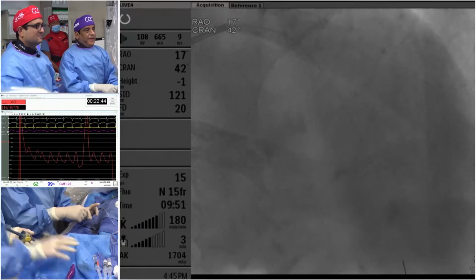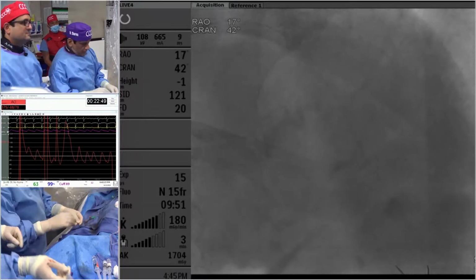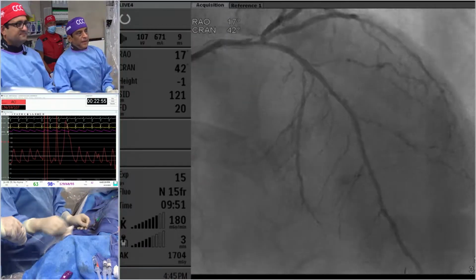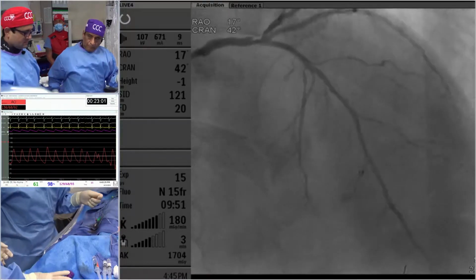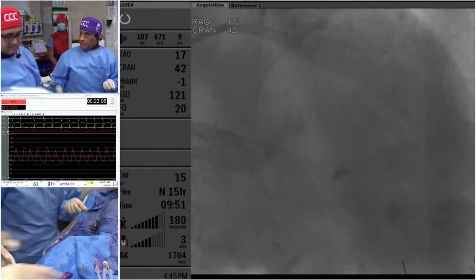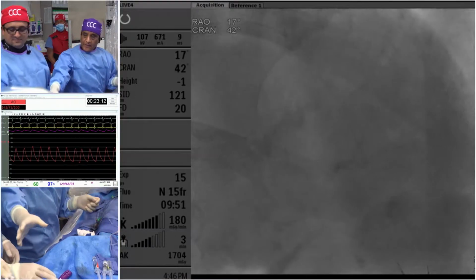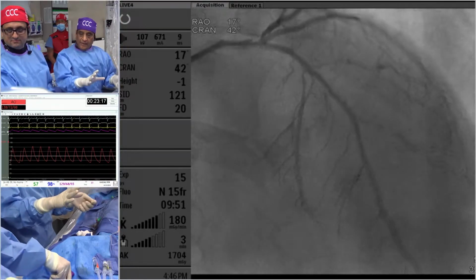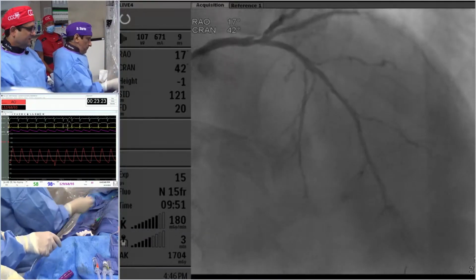So we do the stent in the middle, and we can put a 2.5 by 30, which was supposed to be a Synergy. What was the other vessel? 2.5 by 33. Let's put it in the middle only, and then we'll see, and hopefully they'll be ready by that time. What do you have? 33, 38, whatever. 38. So you're going to leave that distal segment? What John Fox said is to leave the distal segment to good balloon angioplasty, and maybe it will remain fine. Go to the rota PTCA, or DCB.